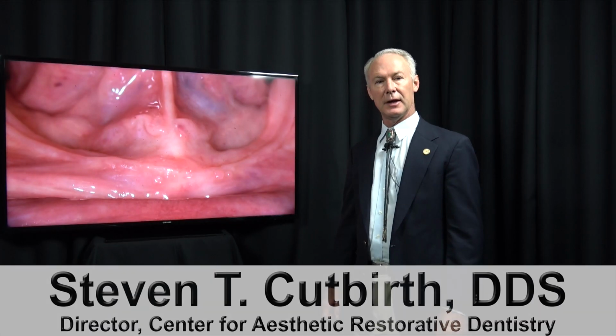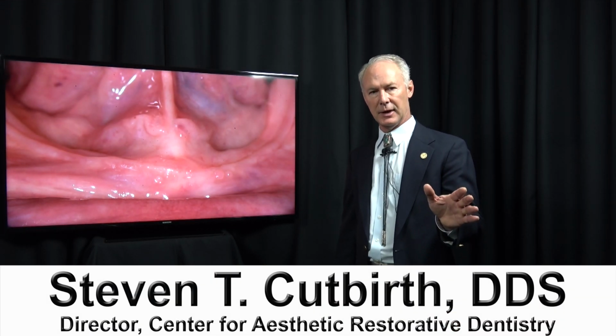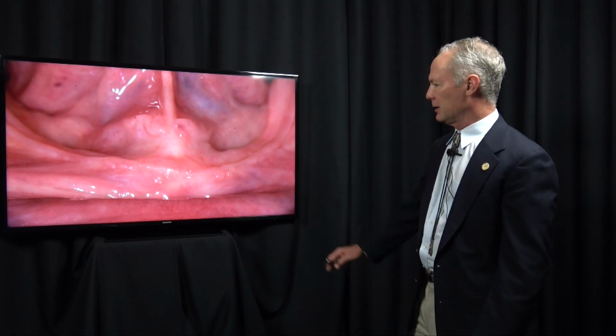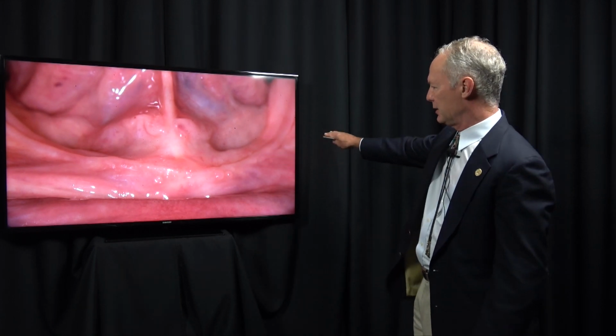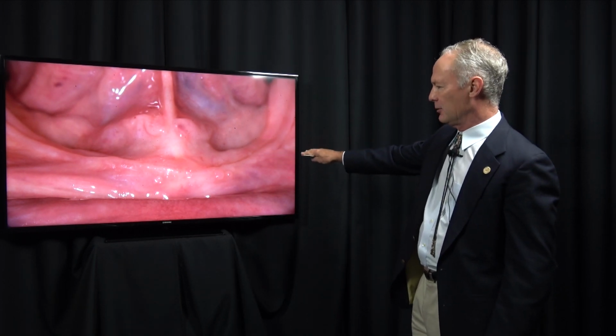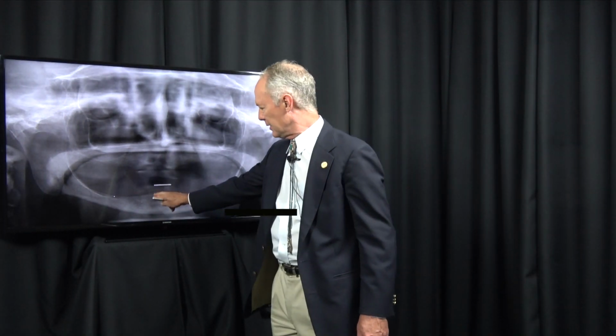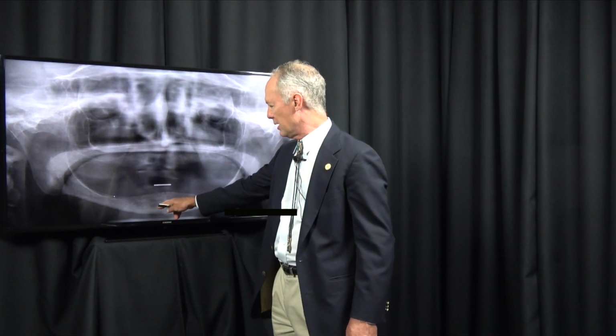We're going to discuss placement of small diameter implants on a flat mandibular ridge to support a removable denture. Now in this particular case, you can see how the ridge is very flat, and you'll notice on the radiograph that this is very dense bone, D1 bone, with not a lot of trabecular bone or medullary bone.